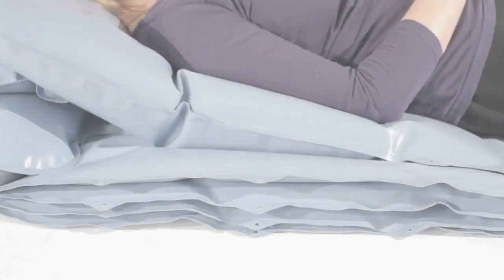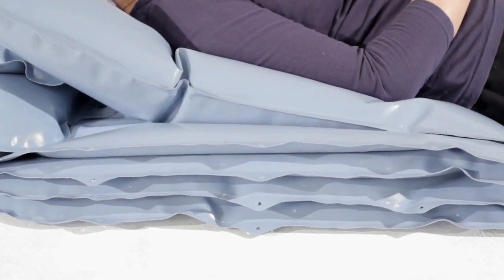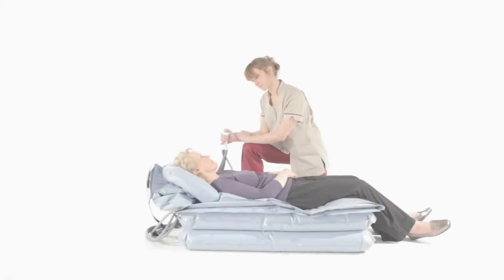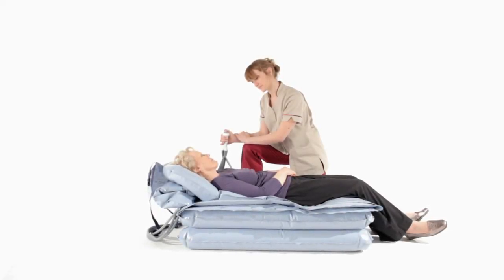Press and hold number two. This inflates the second section. The air will automatically stop once the section is fully inflated. Apart from the backrest, it's essential that all sections are fully inflated before moving on to the next.